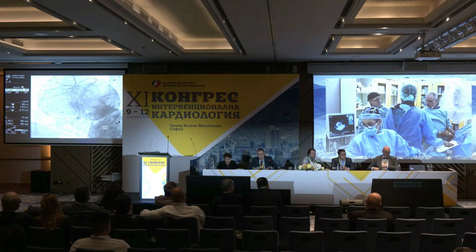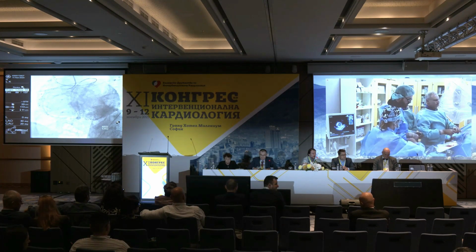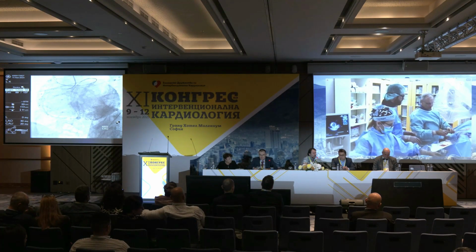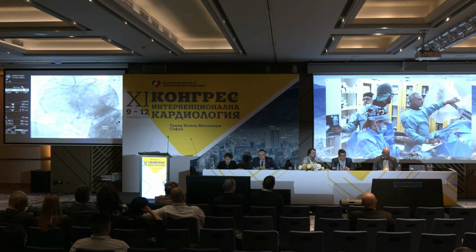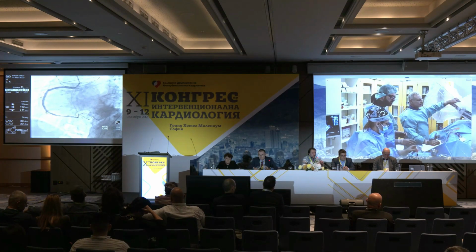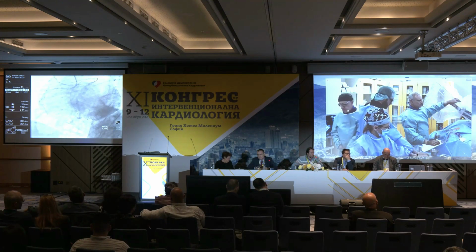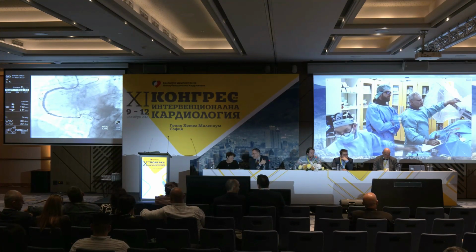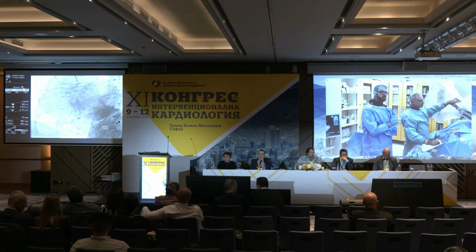Because something, probably we destroyed the catheter. Yeah, but we are going to take another one. George, if you are worried, you can put a balloon there for 2 to 3 minutes. No, that's what I was thinking of doing. Yeah. Let's do an echo on the patient. Anyway, we'll clarify here. It doesn't look like it's going into the pericardium. No. It has the course of a branch. But anyway, we just put a balloon there. It is a concern. Yeah.